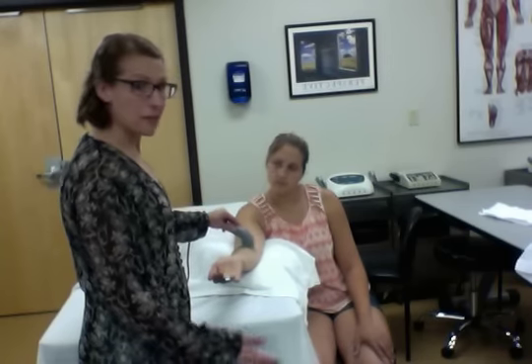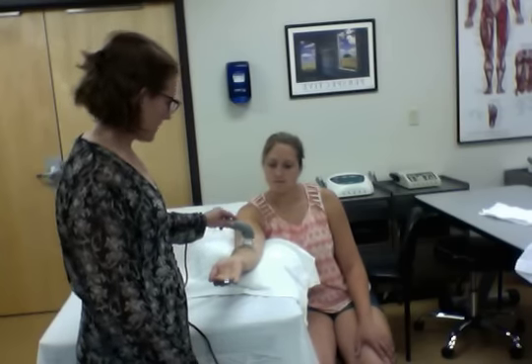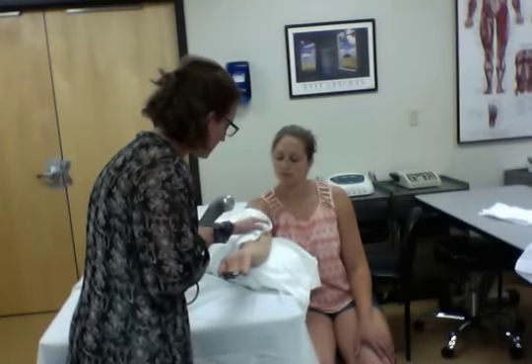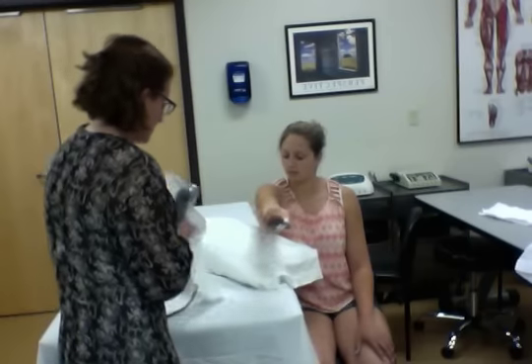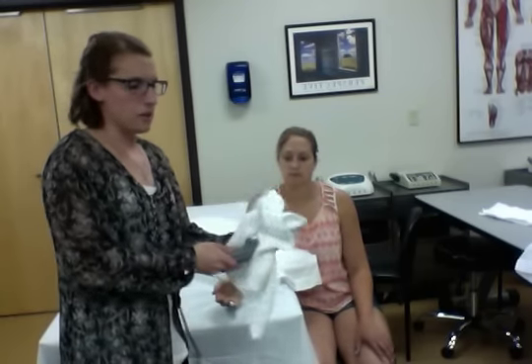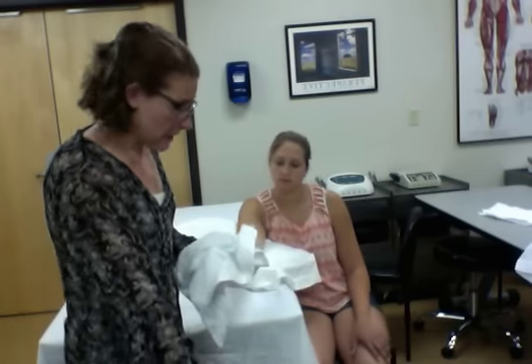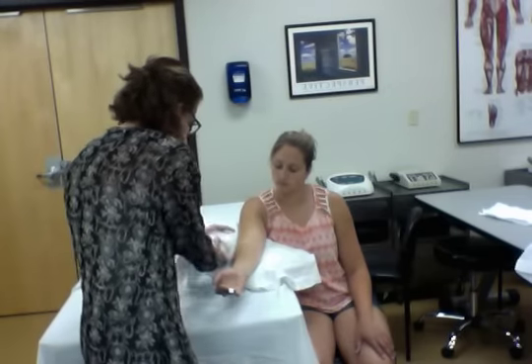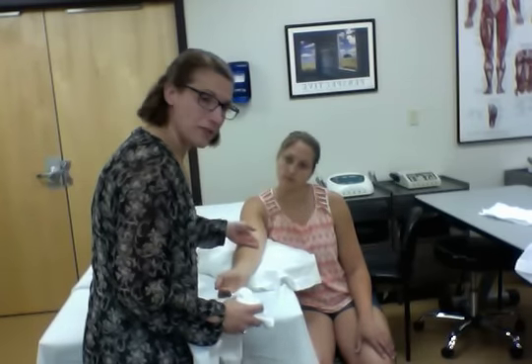All right, so we're going to say that we've come to the end of our treatment session. And I'm going to go ahead and wipe off JC's elbow first. And then the ultrasound head, which I would then wipe with rubbing alcohol. I'm going to inspect her skin, other than a little more gel. It's maybe a little bit red. It feels kind of warm.